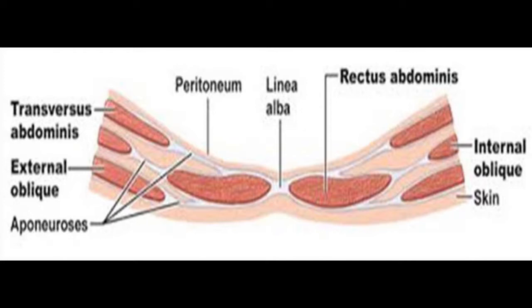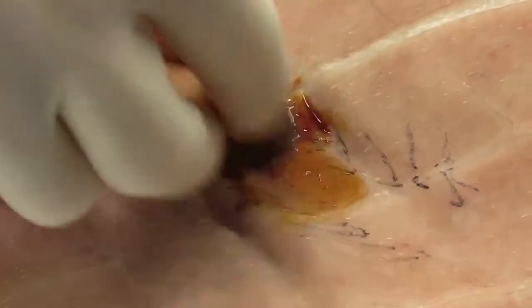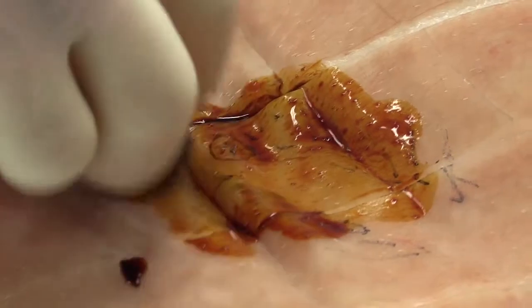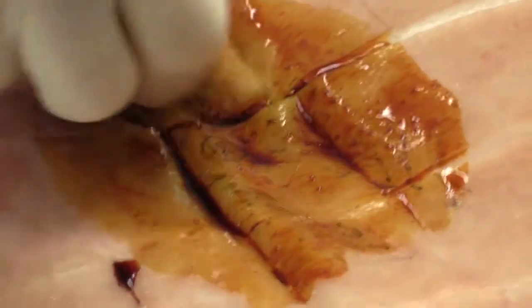The procedure begins with preparing and draping the area. So we use a povidone iodine soaked swab, and the cleaning technique is concentric circles, spreading from the point that you need maximally cleaned, in other words, the point of insertion.